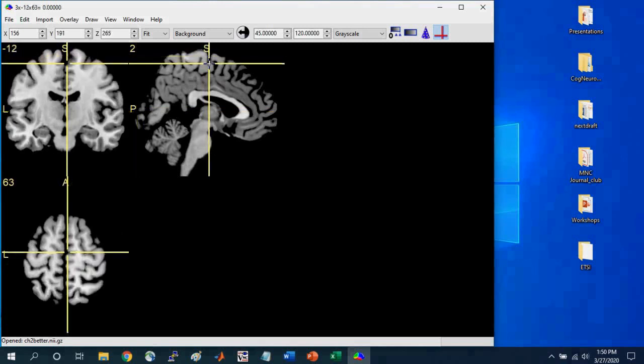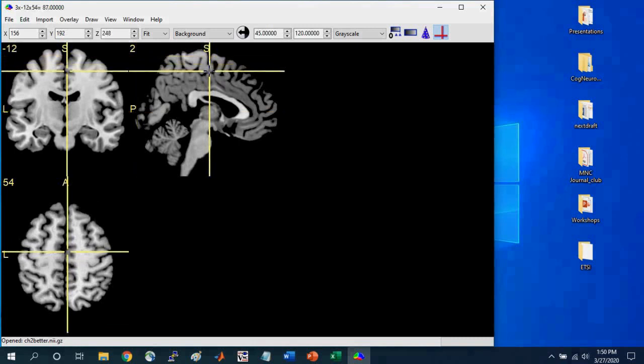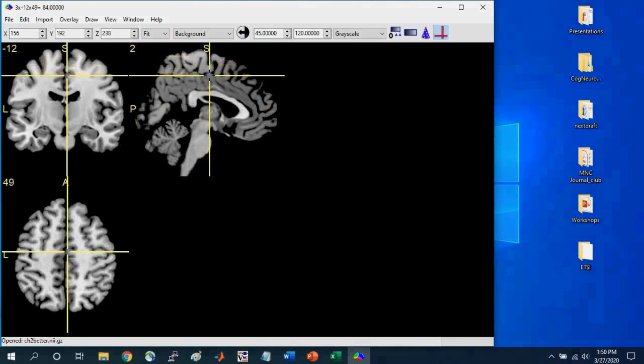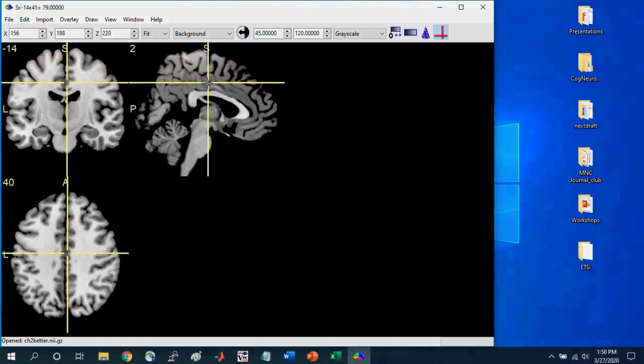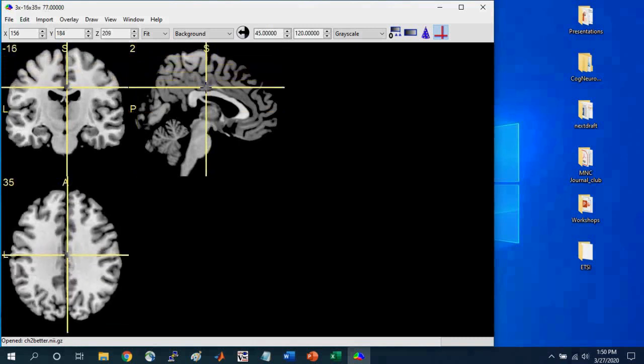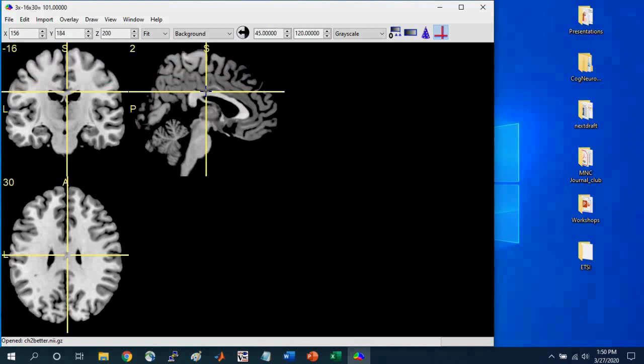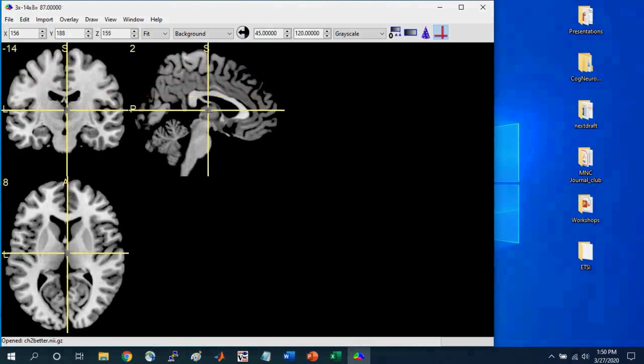And you can hold, select and hold the left click, and just scroll down. Scroll more inferiorly. Also called ventrally. So the inferior is also called the ventral side of the brain.